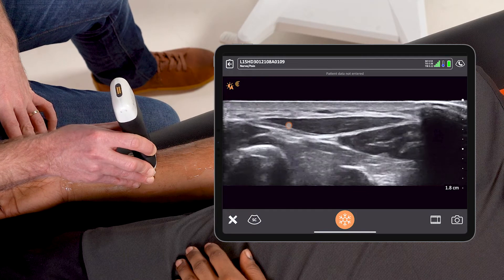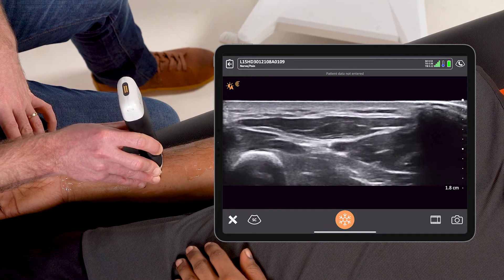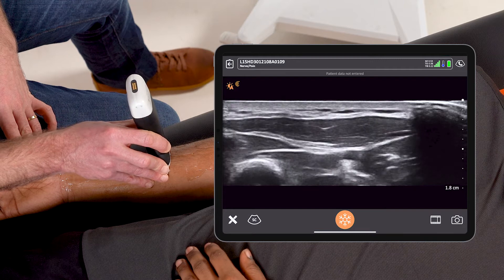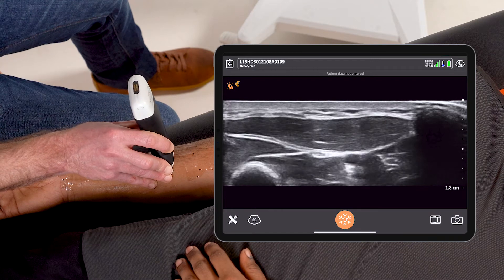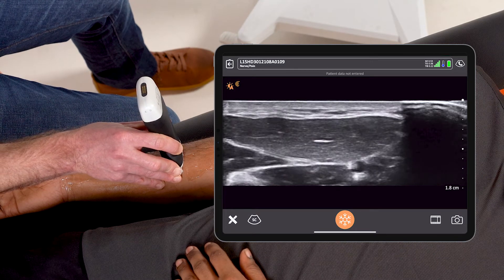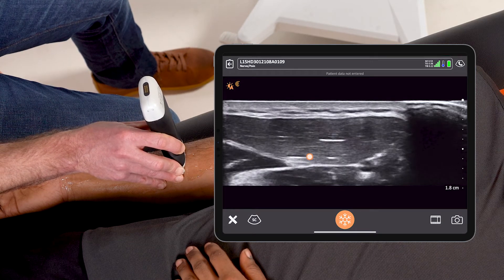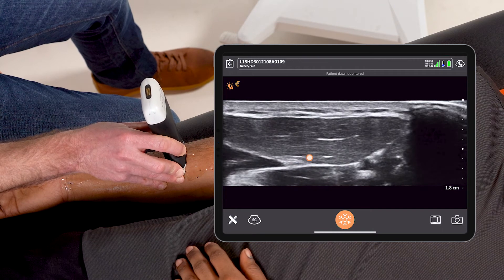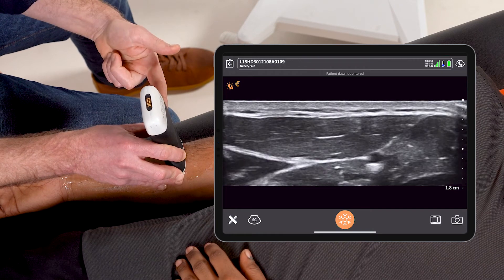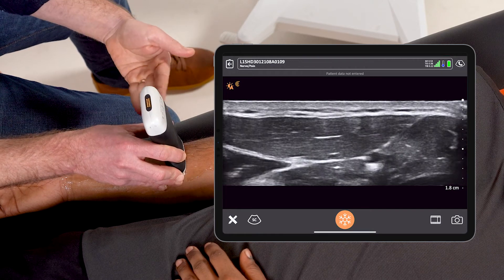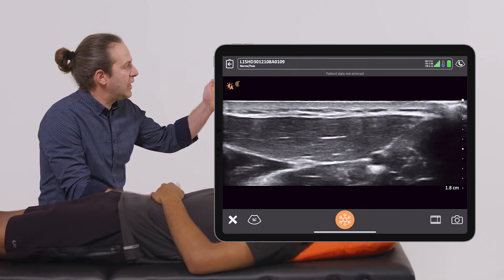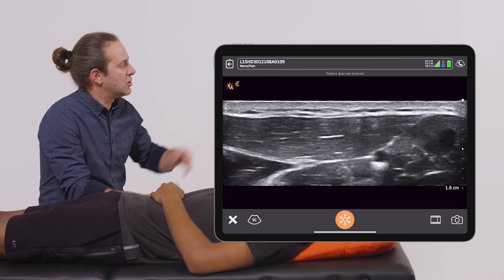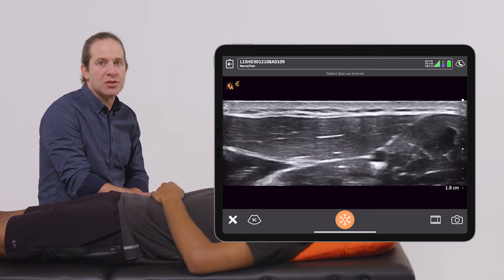And then I can follow that structure proximally until I watch it diverge from the artery itself, giving me a perfect landmark spot where I can insert my needle in real time in the mid forearm, avoiding any risk of intra-arterial injection or damage to the surrounding structures.